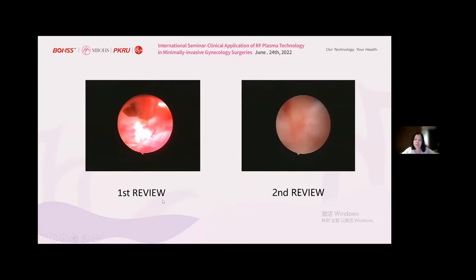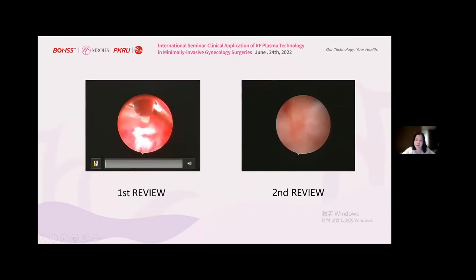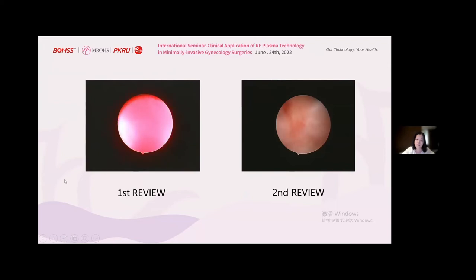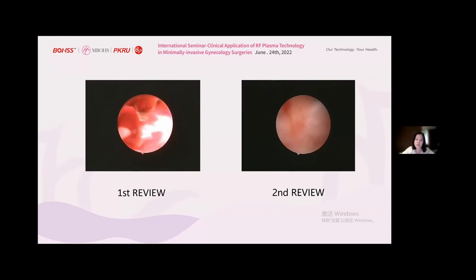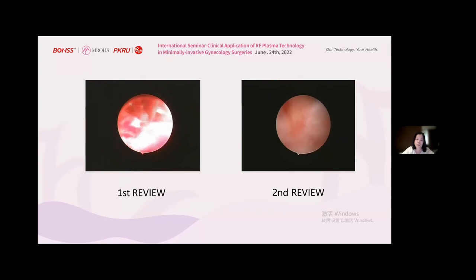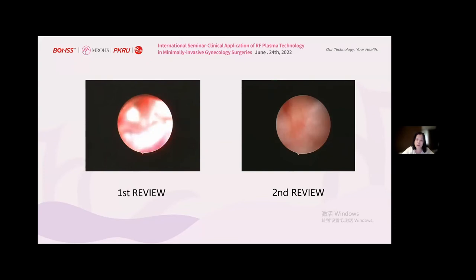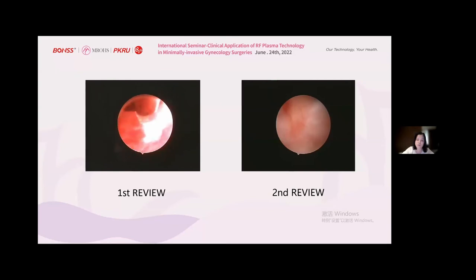One month later, we took the first review. The size and shape of the uterine cavity is nearly normal, but there is still a little intrauterine adhesion. We performed cold knife resection of intrauterine adhesion with scissors separation under direct vision. Cold knife can minimize damage to the endometrium and prevent intrauterine re-adhesion. Scissors can be used to cut radially along the wall of the uterine cavity. If the corners of the uterus adhere to each other, they can be separated to open the bilateral fallopian tubes under B-mode ultrasound guidance.